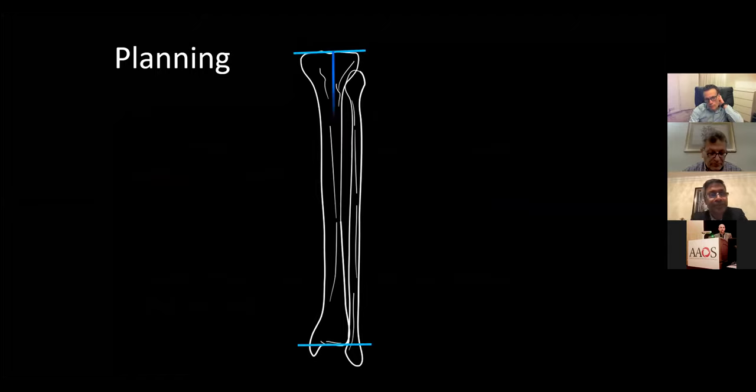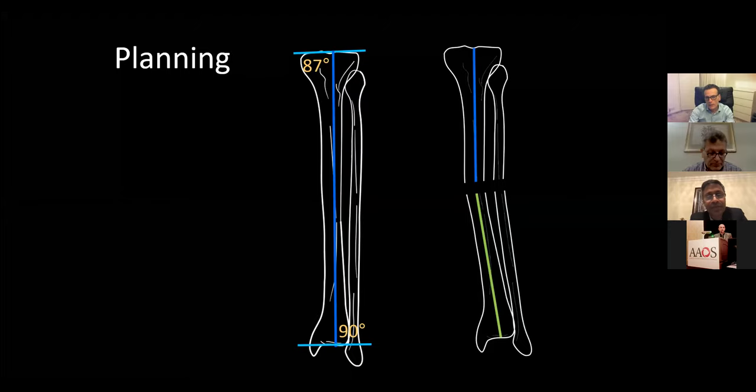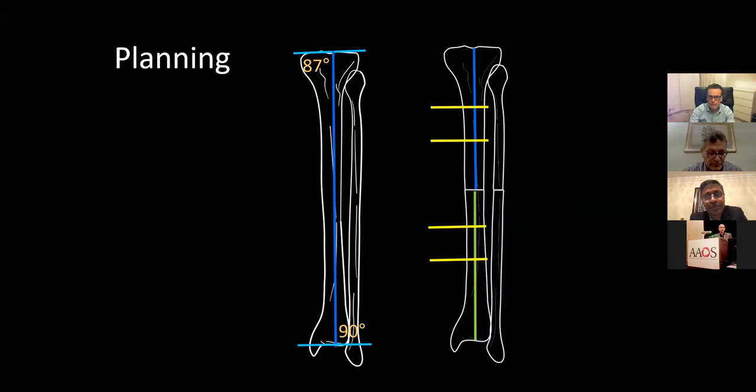So we've learned how to draw the anatomical and mechanical axes, which are the same, as we said yesterday, parallel on the tibia. It's pretty straightforward for a case of a diaphyseal osteotomy, where the mid-diaphyseal lines are easy to identify, and it's quite simple placing our pins 90 degrees in the diaphysis. By doing so proximally and distally, we can see by placing the pins parallel how we achieve correction of the deformity. Very simple illustration of the diaphysis.